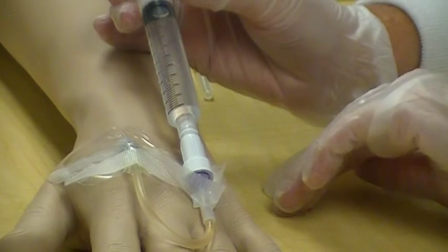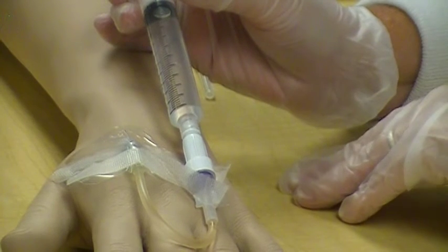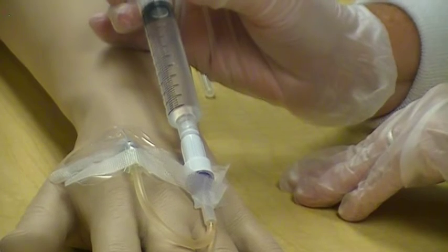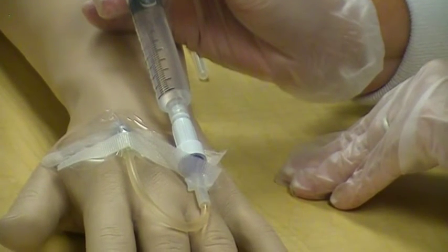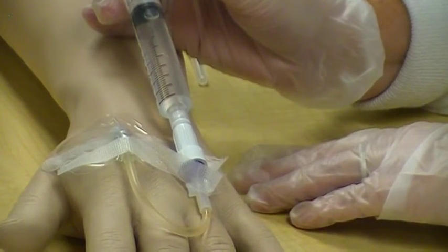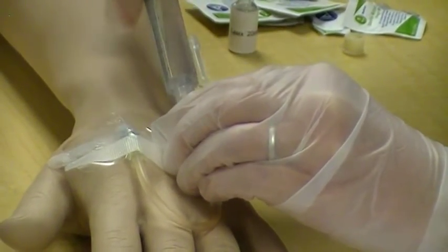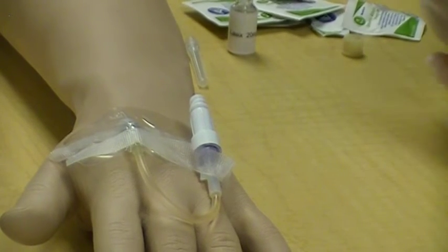So again, we're holding our watch close. We're dividing it up again if you want to do the 1/4 of a milliliter over 15 seconds, again, whatever you prefer. Just nice and slow, and again, the purpose of this is to push that rest of that medication. So we're going to say that we have pushed the medication over the 1 minute. We're going to take our saline flush off, and again, we need to clean up our supplies.